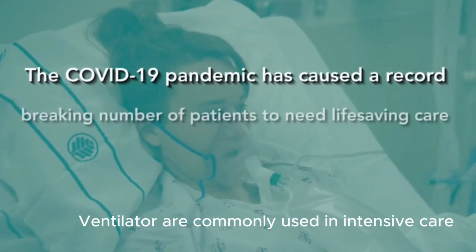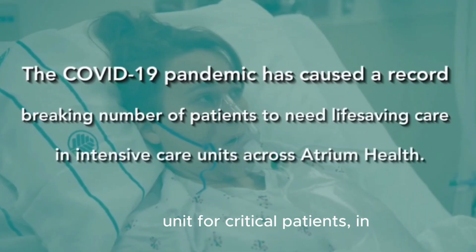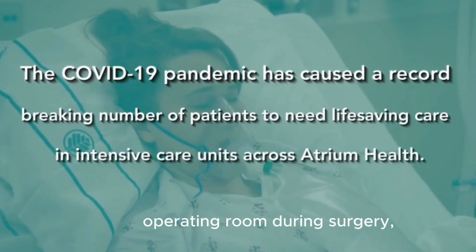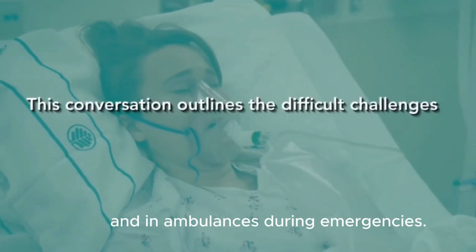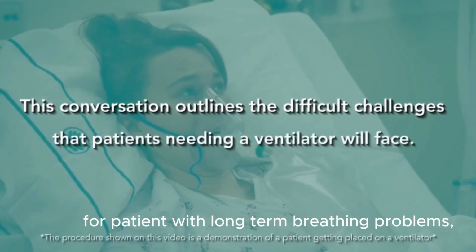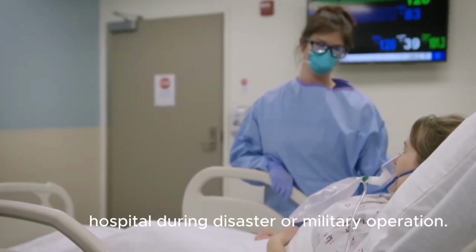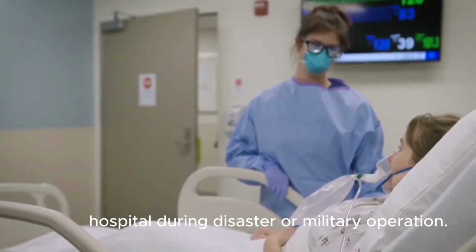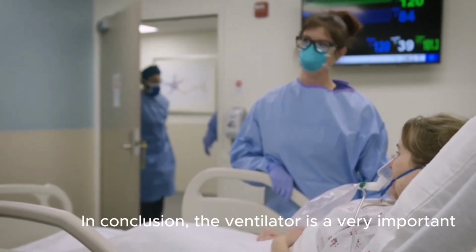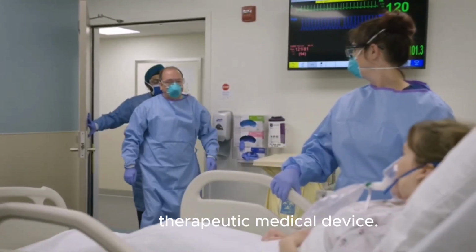Ventilators are commonly used in the intensive care unit for critical patients, in the operating room during surgery, and in ambulances during emergencies. They can also be used for home care for patients with long-term breathing problems and in field hospitals during disasters or military operations. In conclusion, the ventilator is a very important therapeutic medical device.